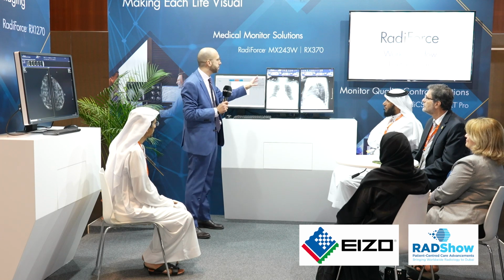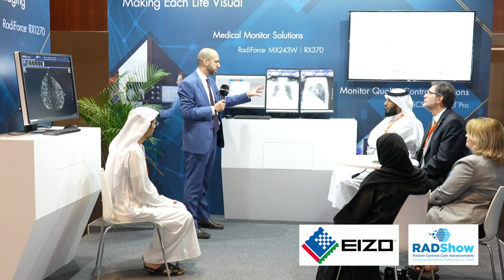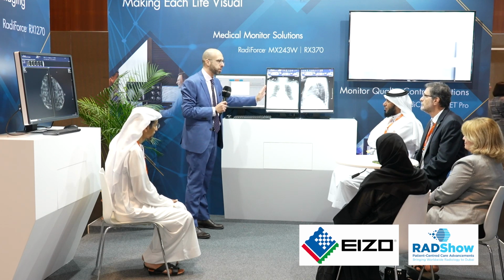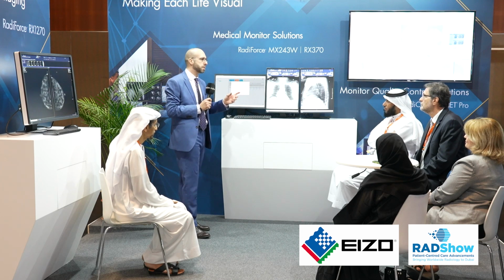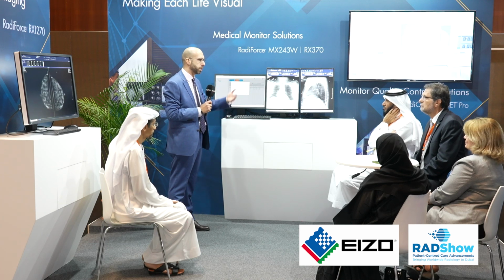So this is something we can do either on the client site when we come and calibrate, or when we send remote calibration, it will auto-calibrate alone. The time it takes is around 10 minutes, I would say, on average, to do the calibration. It will also give you the report.